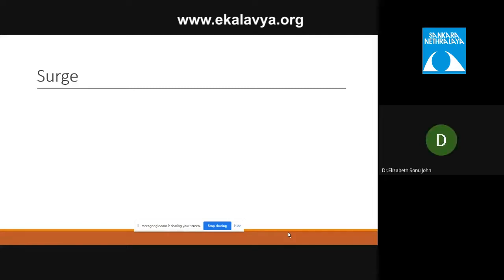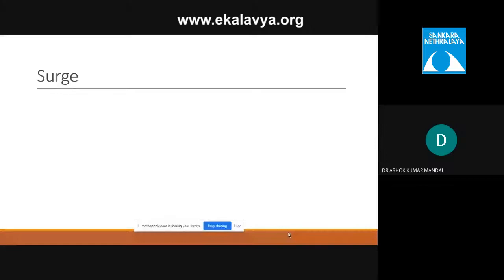Somebody, surge during phaco, ma'am. When the obstruction is suddenly released at the phaco tip, there is a sudden withdrawal of the fluid that causes the collapse of the AC.